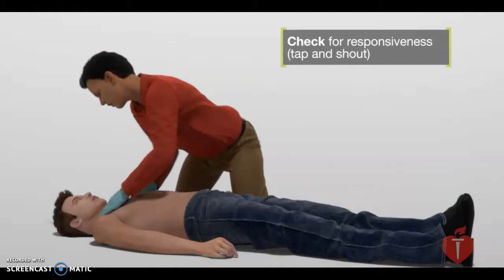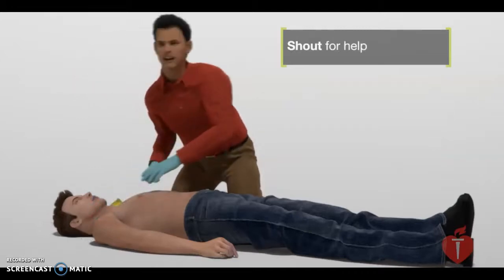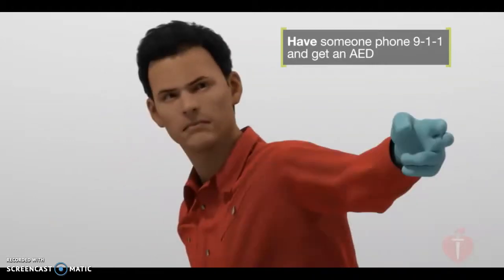If the person is unresponsive, shout for help. Sir, are you okay? Are you okay? Help! Help! I need help! And ask someone to phone 911 and get an AED. You, phone 911 and get an AED.